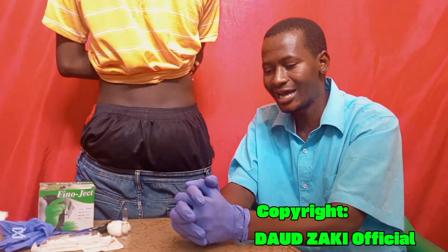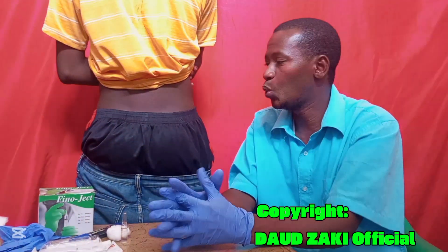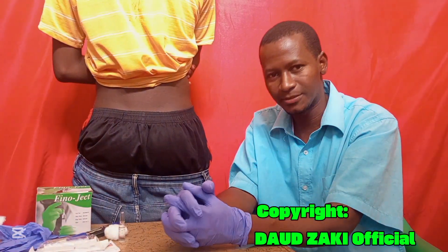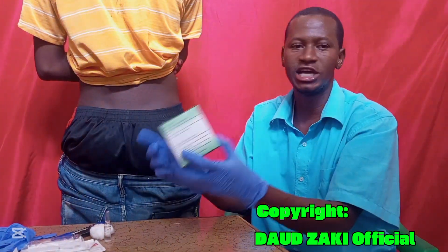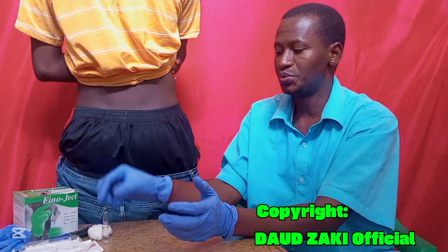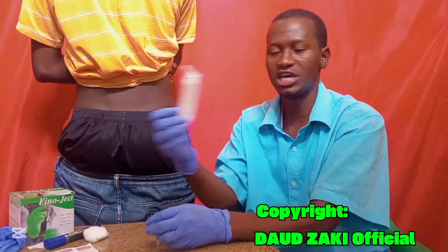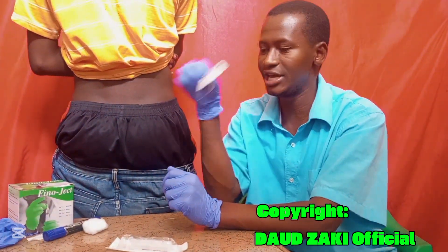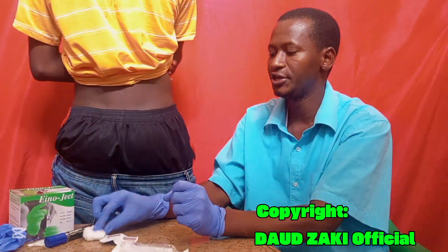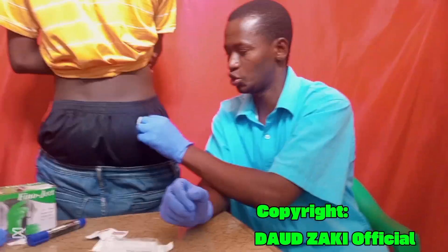Before you start, make sure you wear gloves to maintain hygiene and avoid cross-contamination between yourself and the patient. Gather all required supplies: a 21-gauge needle, a medication ampoule, a syringe, alcoholic swabs to clean the injection site, and cotton wool to apply pressure after the shot.